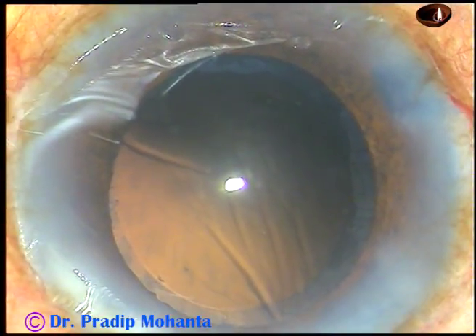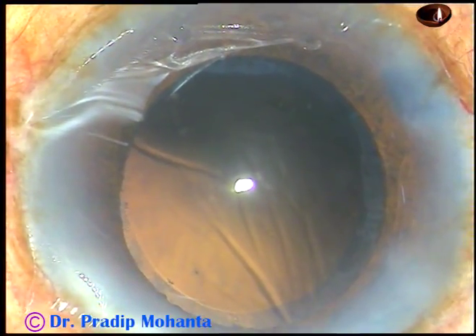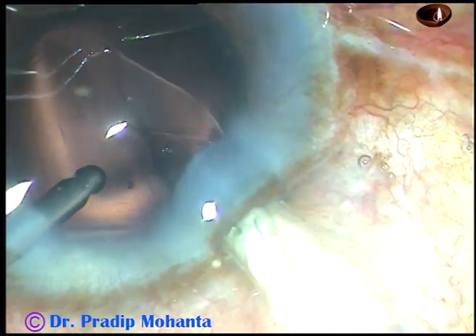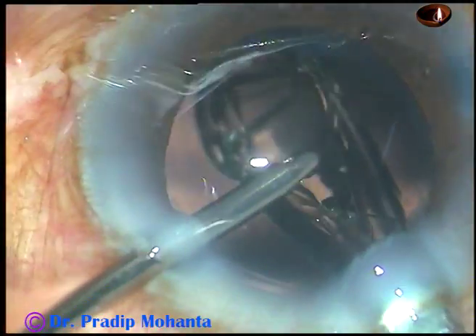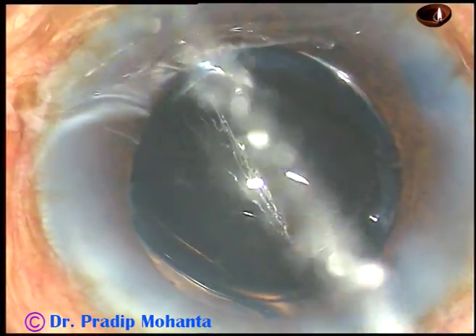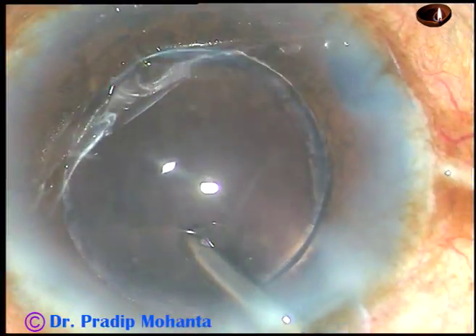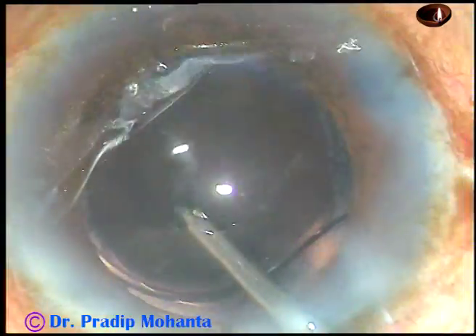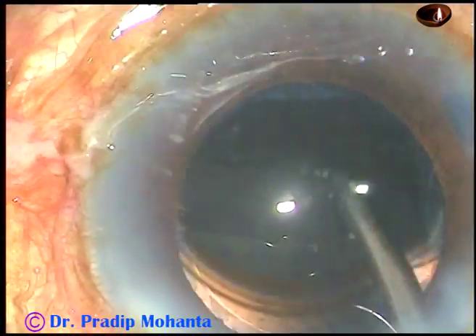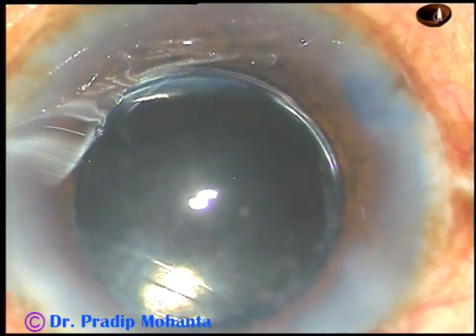Now is the time to implant a foldable intraocular lens. This is what you can call hydroimplantation — the anterior chamber is kept formed by irrigating fluid, and the lens is implanted in the capsular bag. The lens is now in the capsular bag.